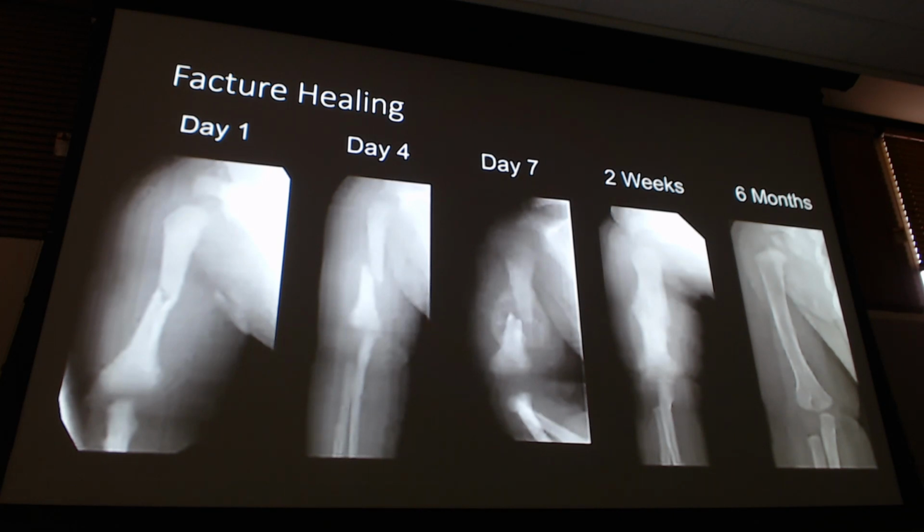That periosteal reaction can pop up on an x-ray, right? And sometimes that's the sign. It won't be this obvious, right? But sometimes we'll see some fractures here in this course to where you're following the cortex, and then there's a small little kind of bump, and following down, that's a sign that maybe there was a hairline fracture there that wasn't seen on x-ray, but it's healing, right? Because you have a small periosteal reaction, like right in here. So we'll take a look at more of that.